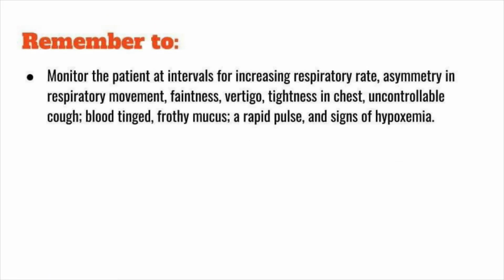Lastly, monitor the patient at intervals for increasing respiratory rate, asymmetry in respiratory movement, faintness, vertigo, tightness in chest, uncontrollable cough, blood-tinged or frothy mucus, a rapid pulse, and signs of hypoxemia.